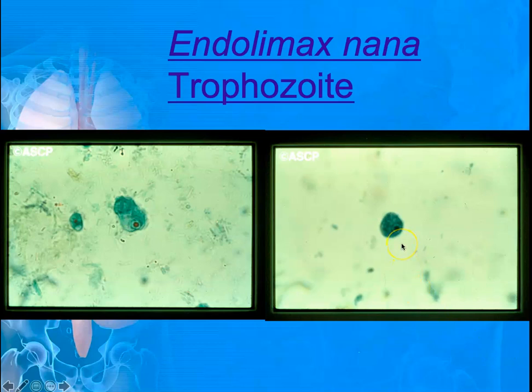So here's some other pictures. I know you can't tell size, but it's fairly small. One nucleus. You should be able to tell that this karyosome is a lot bigger and more blot-like than the previous karyosomes we've seen.